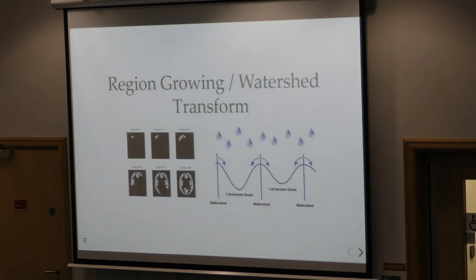Then you move on to slightly more complicated algorithmic approaches like region growing, where you start from a given pixel and you expand out, incorporating different pixels based on a given selection criteria, hopefully building up the section or area you're interested in. There's other more lateral solutions like watershed, where you treat the image like a height map and fill it in as though you're filling in a physical piece of terrain.